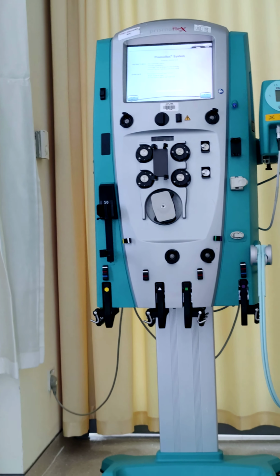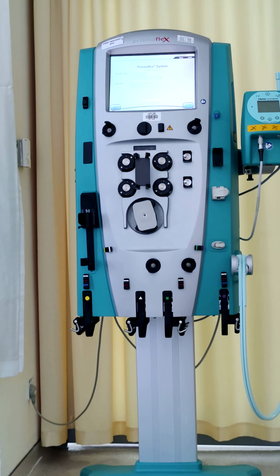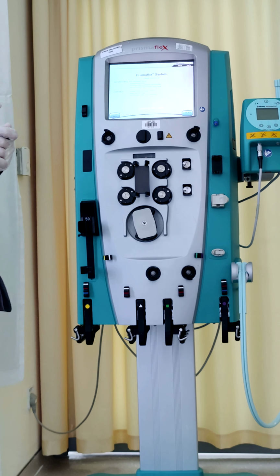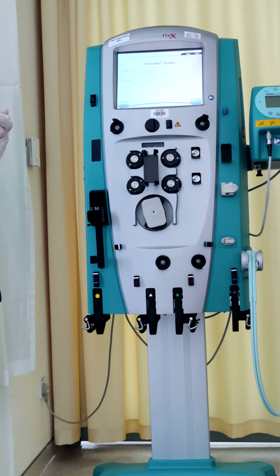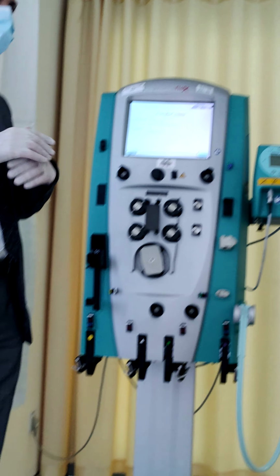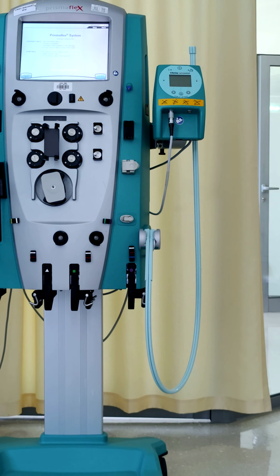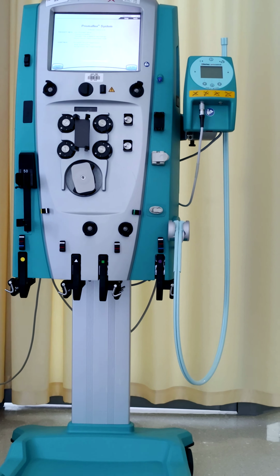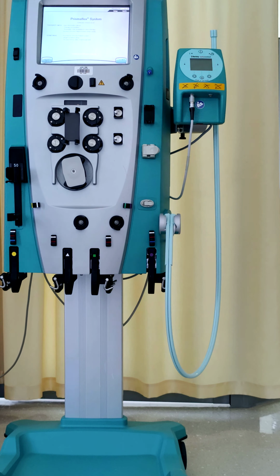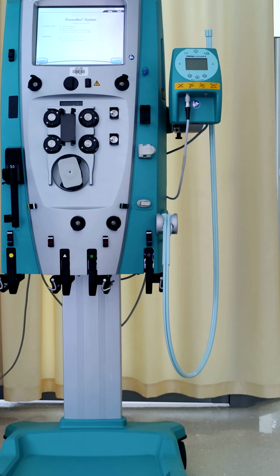Second thing, you will give them the plasma volume. Do we have to calculate it, or we just put the hematocrit and the weight, and the machine will do it? The machine will do some part, and I have to calculate part. Then you will put the rate for replacement to decide how long the treatment will be. Is it a replacement dose or replacement rate?